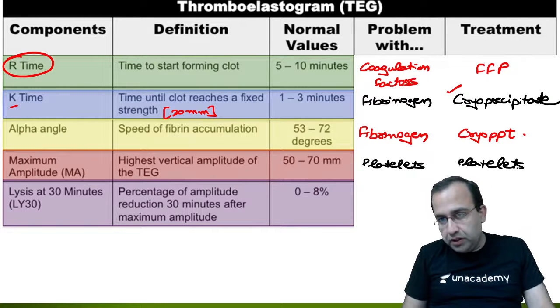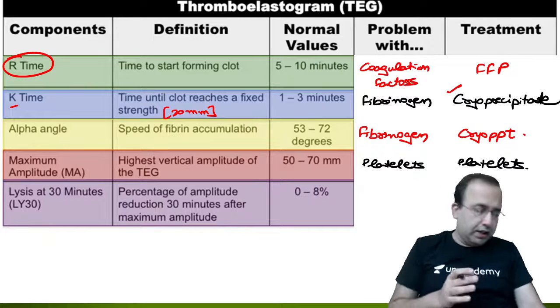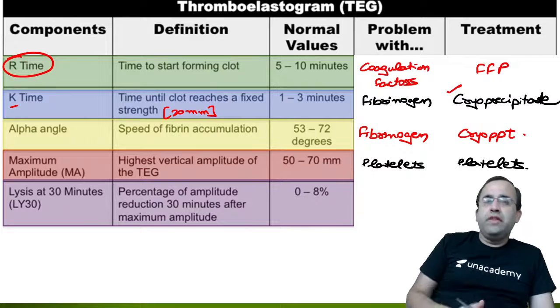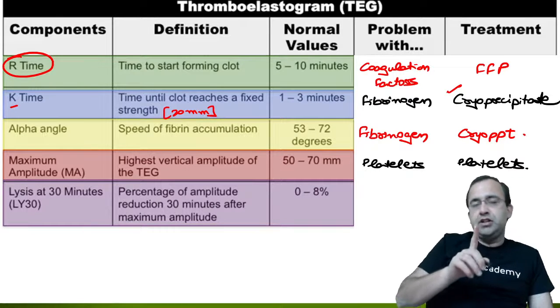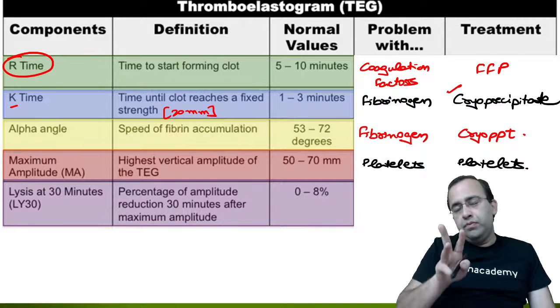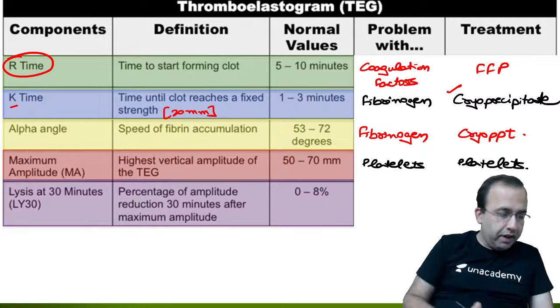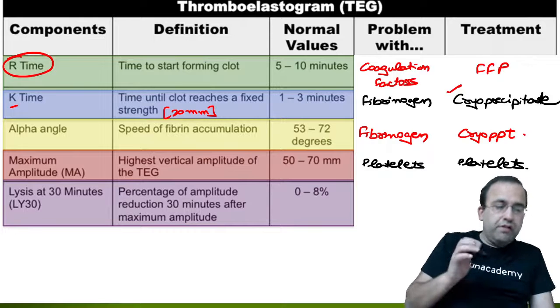Now, before we go further, I want you guys to tell me this. What is the storage temperature for platelets? I am waiting for an answer on this. We store them at minus 70 degrees Celsius, minus 30 degrees Celsius, room temperature, 4 degrees. Everybody, I want all of you to tell me this. Agreed, we store them here.